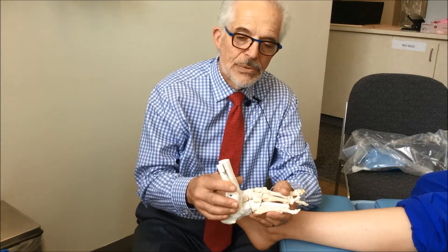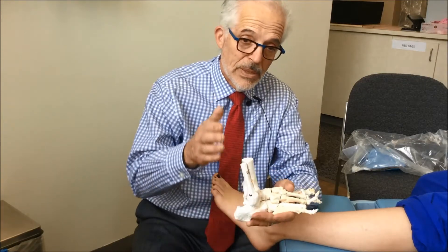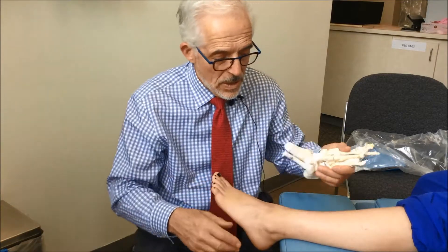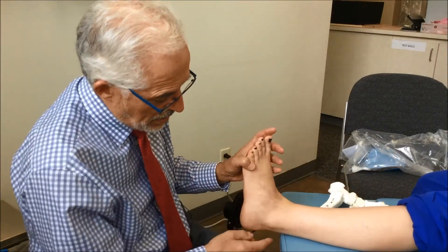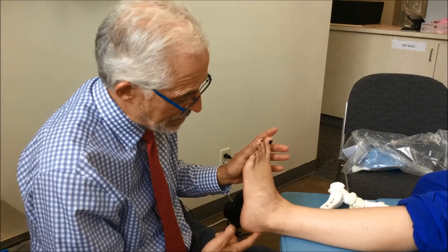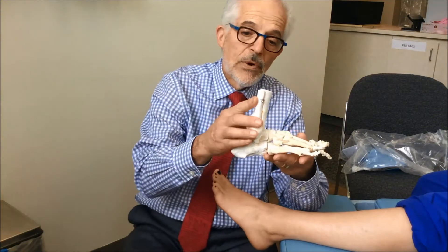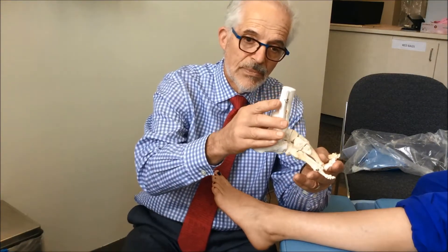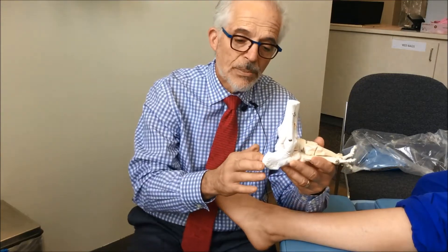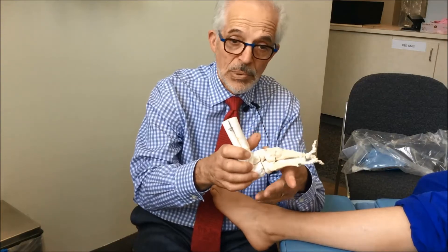I'm going to show you how to use what I call the Achilles splint to help eliminate a tight calf muscle. A tight calf muscle, which inserts into your heel as the Achilles tendon, doesn't let your leg go forward enough during normal walking. When that happens, it can lead to several problems in the foot, including heel pain in the back or the bottom of the foot and plantar fasciitis.